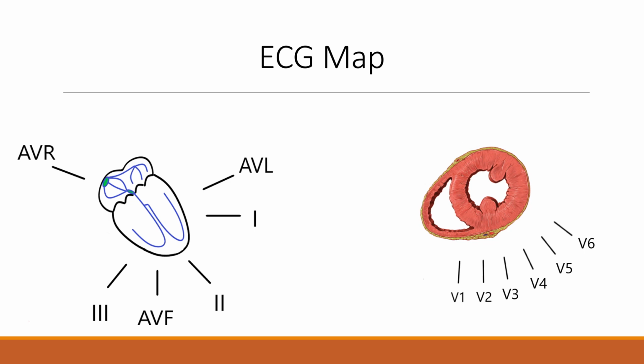On the other side there, you can see your precordial leads. And so those are your chest leads. Now, to orient you here, the patient's head would actually be coming out of the screen at you. So at the top of that picture would be the patient's back, and at the bottom would be the patient's front, which makes sense. The V1 through V6, that's where we put the stickers, right? We put them on the chest, and we look. So they look directly backwards.